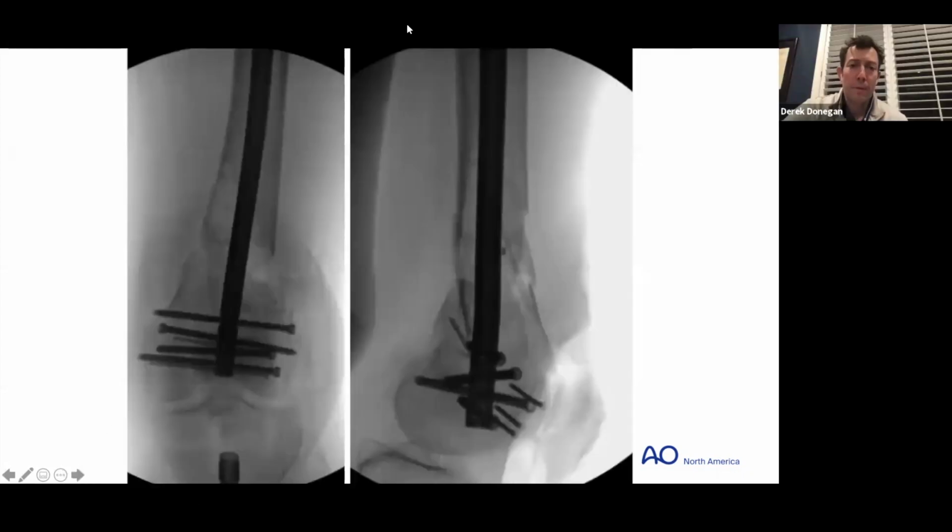Yeah, I think you bring up a lot of good points. I think thinking about the next surgery, obviously you don't always want to presume our fixation constructs are going to fail, but I think it's important to keep that in the back of your mind. But I think an intramedullary device for this is a reasonable choice, given all the things that you and Matt talked about with the metaphyseal comminution, doing a nice job getting an anatomic reduction of your articular surface and then treating that metaphysis with an intramedullary implant.